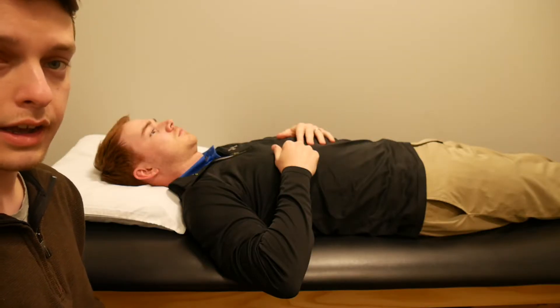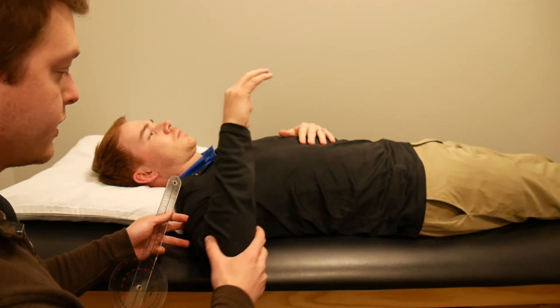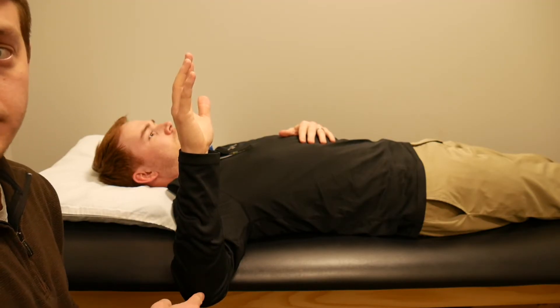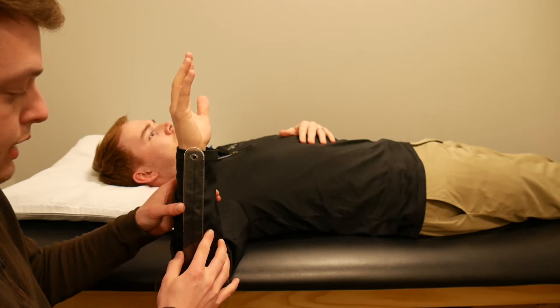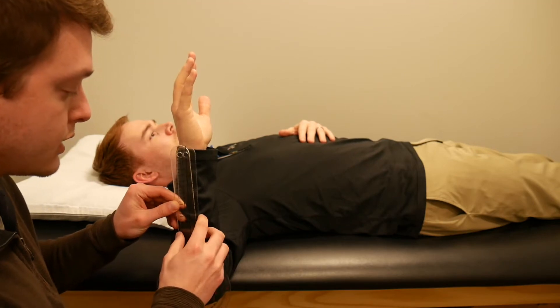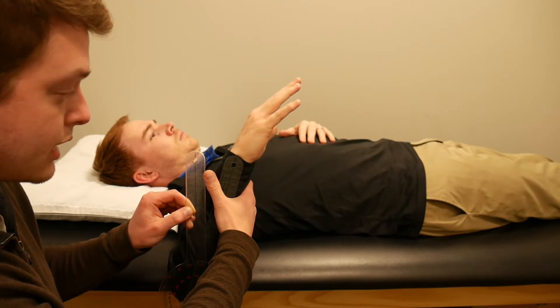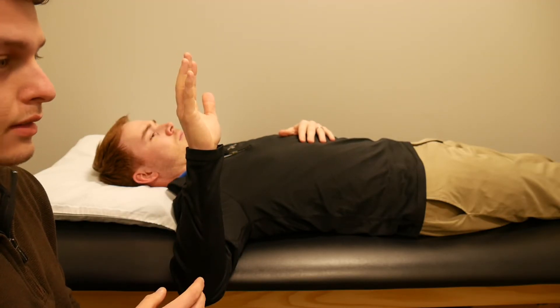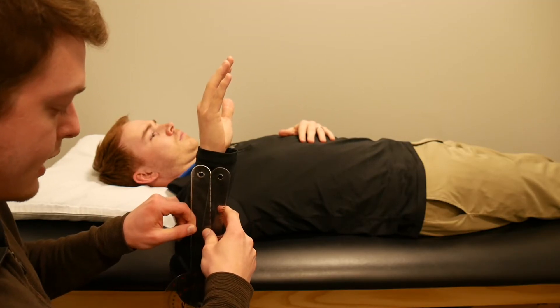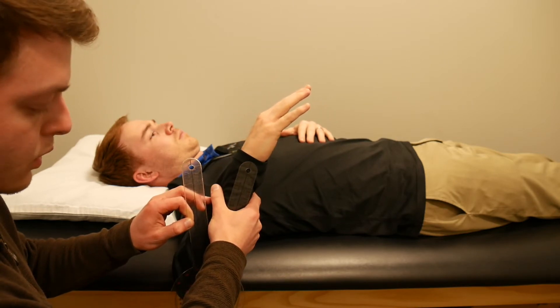Now we're going to work on shoulder internal and external rotation. We'd have the patient lying supine, bring them out into shoulder abduction, and have them place their forearm in the measuring position. For goniometer placement, the axis should be right over the olecranon process of the elbow, the stationary arm stays perpendicular — straight up and down, in a vertical position. To measure internal rotation, the movable arm of the goniometer follows the forearm along the mid shaft of the ulna. Have the patient actively move into internal and external rotation first to get a general idea, then place the axis over the olecranon, keep the stationary arm vertical, and let the movable arm follow the ulna into internal rotation for your measurement.